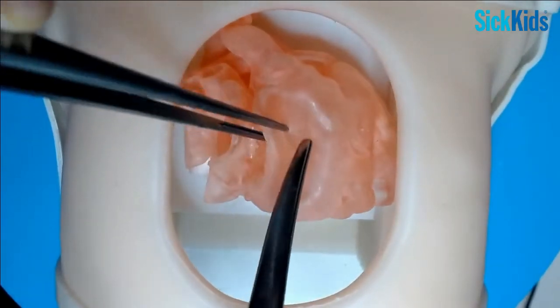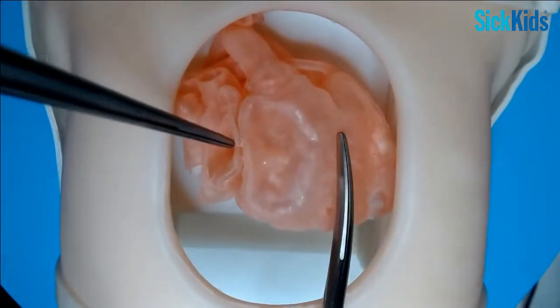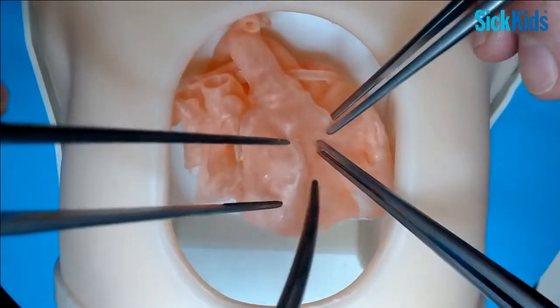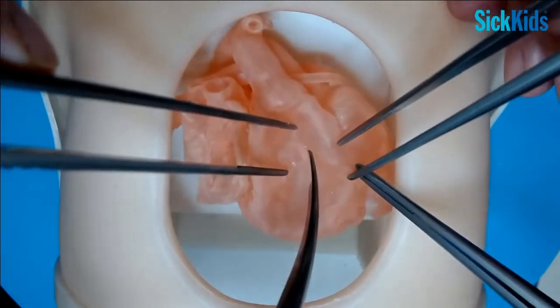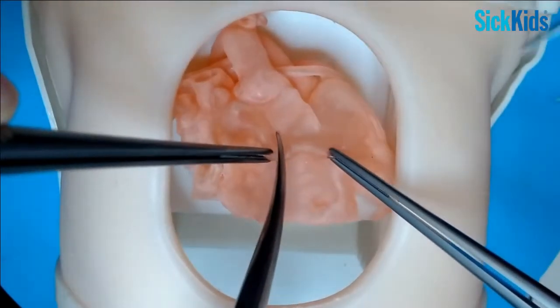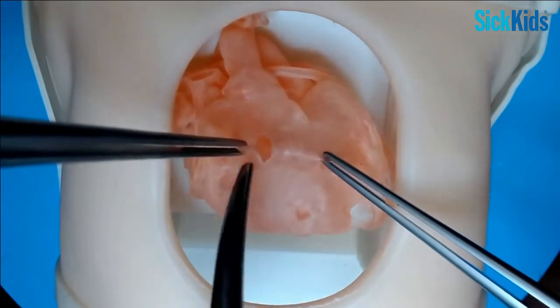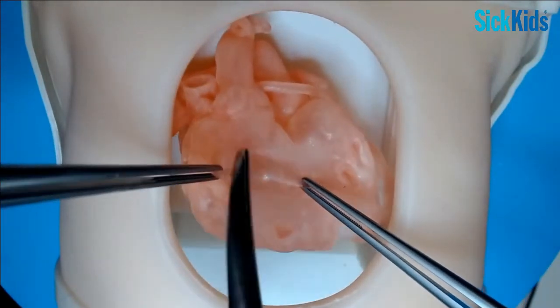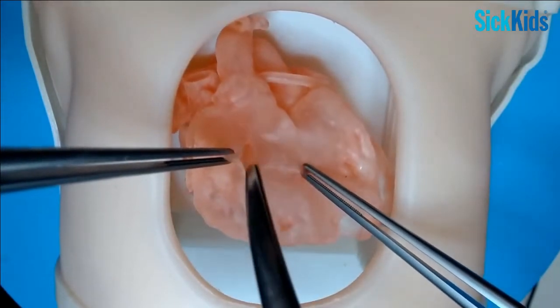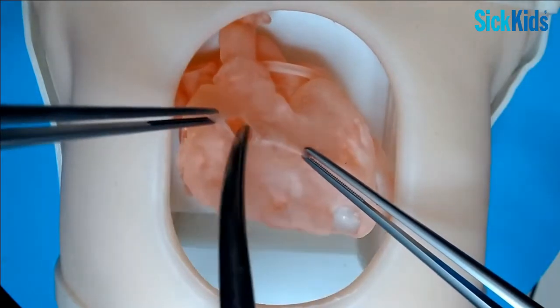I think the best way I can really display it is by doing a ventriculotomy, which may well be what you'd have to do anyway. So you'd be making a ventriculotomy - you make sure you have a feel for where the valve is, how deep it comes down, you start well below it so you don't end up inadvertently damaging the valve.